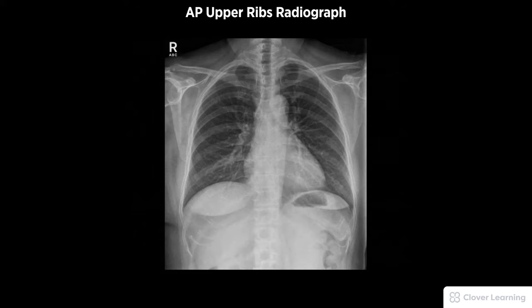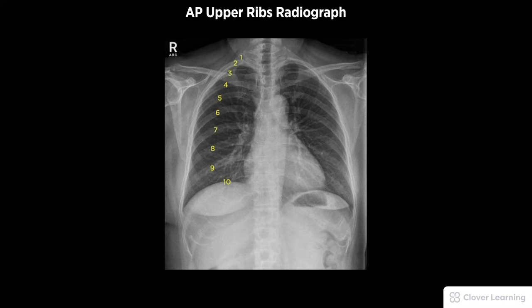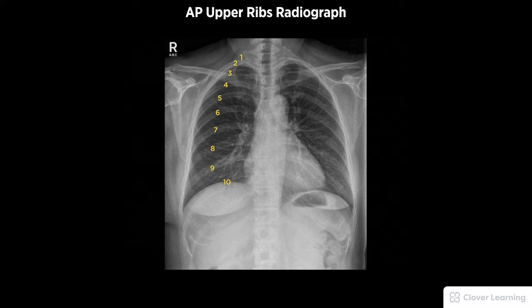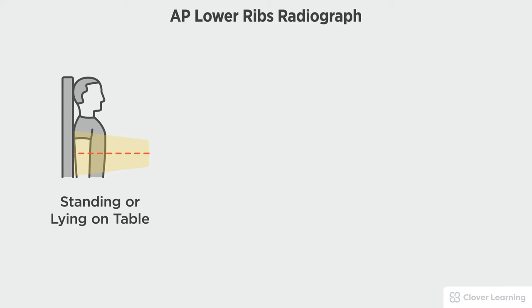A diagnostic AP upper rib radiograph should be free of rotation and motion, and include the first through tenth bilateral posterior ribs in their entirety.